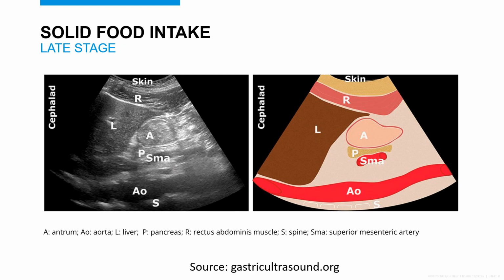Here we have a patient that ate a few hours ago. The stomach looks larger as compared to the empty antrum we saw earlier, and there is not the black inner marking appreciated on the bullseye pattern from an empty antrum. Instead, we see a fuller, more distended antrum that has a heterogeneous mix of contents. The hyperechoic specules are most likely small residual air bubbles or fat.